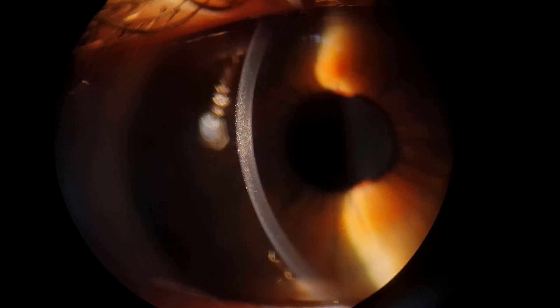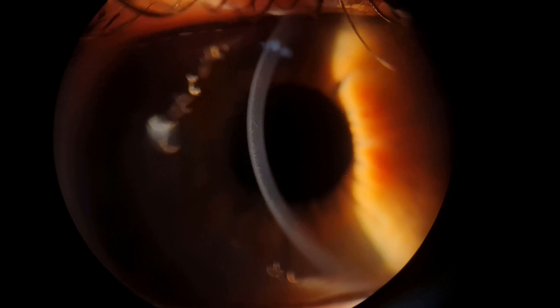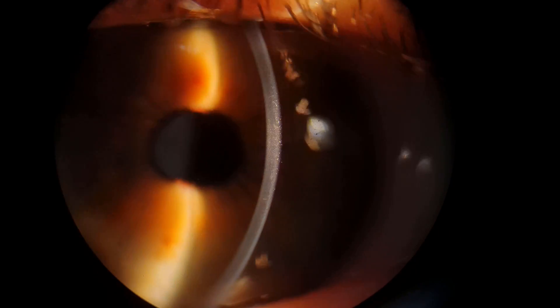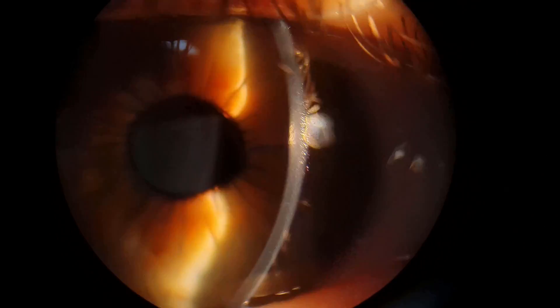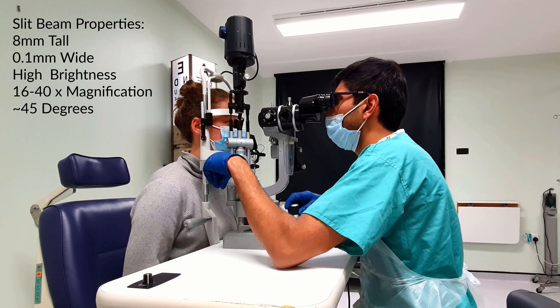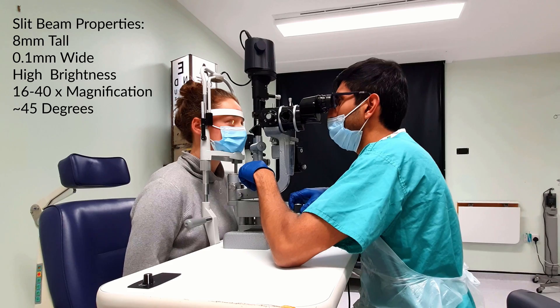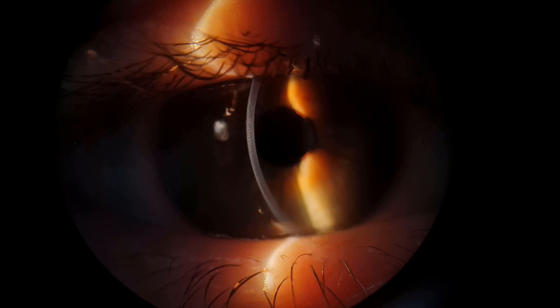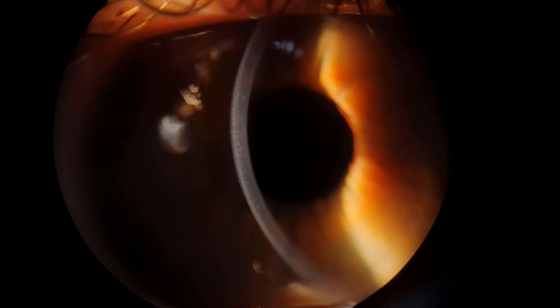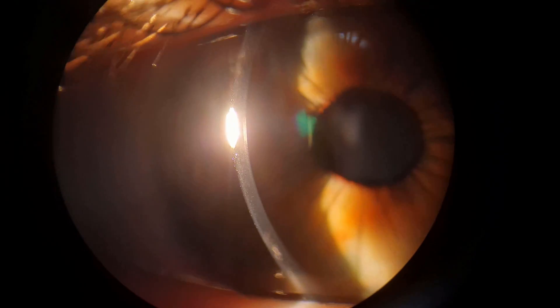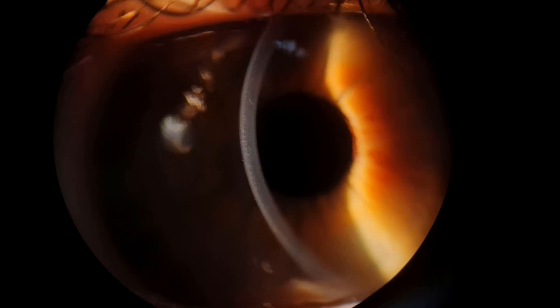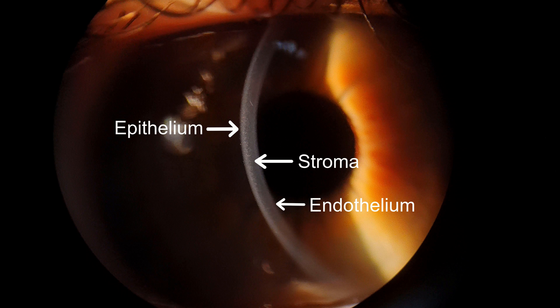If you use a thin narrow beam, you can produce an optical section. This technique can help you to assess semi-transparent structures such as the cornea or lens. For this you should use a tall, thin beam with high brightness intensity. Move the illumination arm to around 45 degrees and adjust appropriately. As you can see, it optically dissects the cornea and you can see a cross section. You can use increased magnifications to help you define specific structures such as the epithelium, stroma or endothelium.